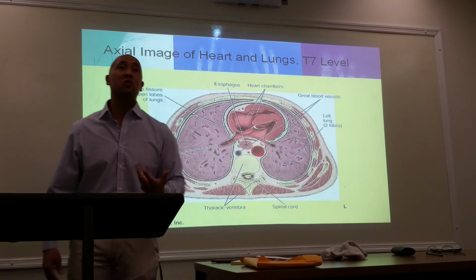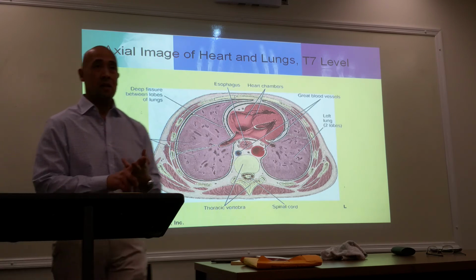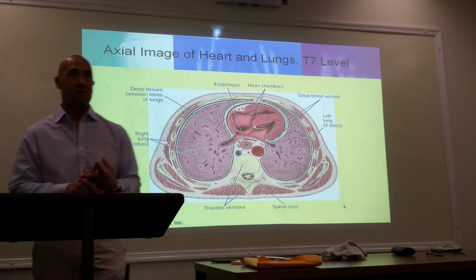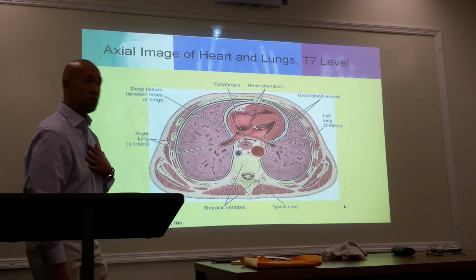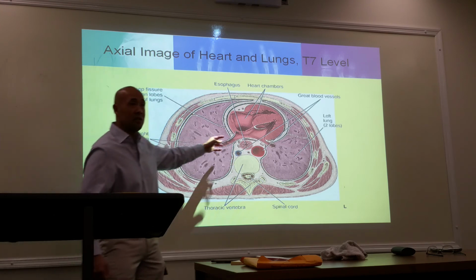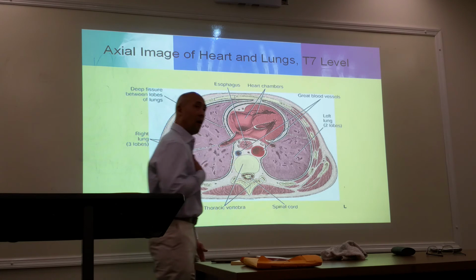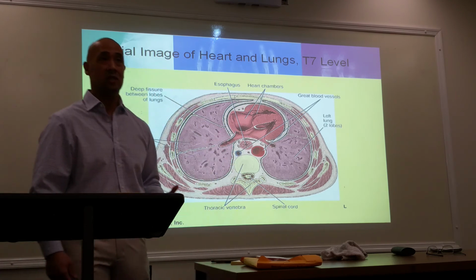This is why when we're doing chest x-rays, there are 2 views that we do. The first one is going to be, is it AP or PA? PA. That means face or chest towards the image receptor, right? Why? Because of the magnification of the heart. Look at the heart orientation. If you're doing a PA like so, it puts the heart closest to the image receptor to avoid any type of magnification.